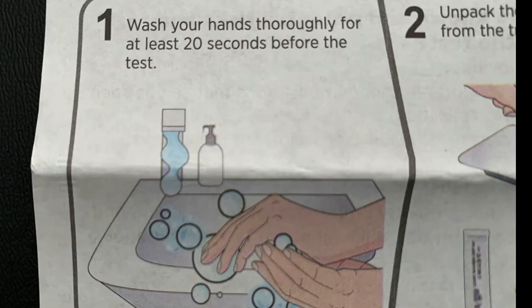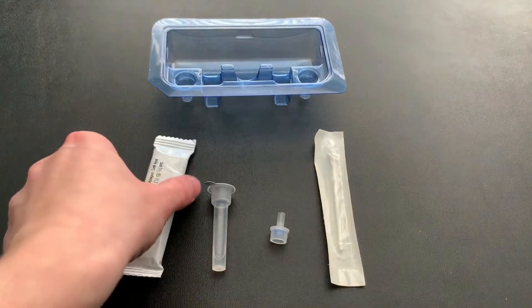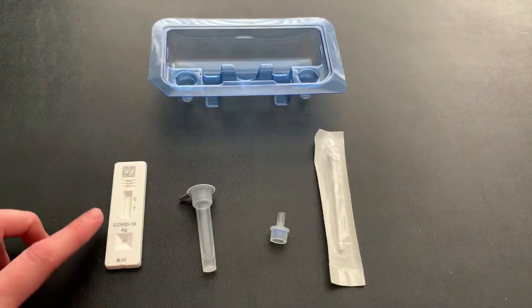Step one: wash your hands thoroughly for at least 20 seconds, then go ahead and unpack these items. Here's your test cassette — go ahead and open it and then lay it flat on the table.